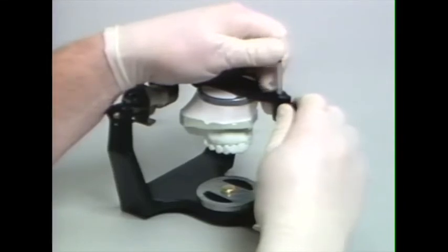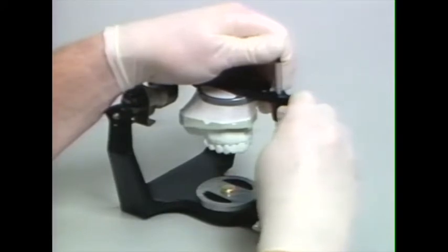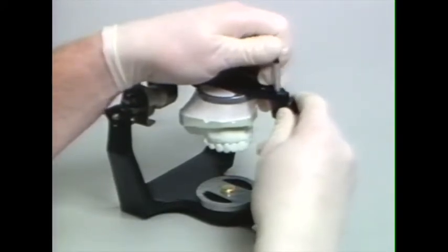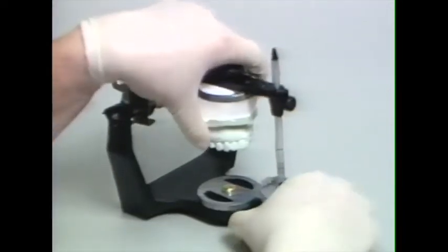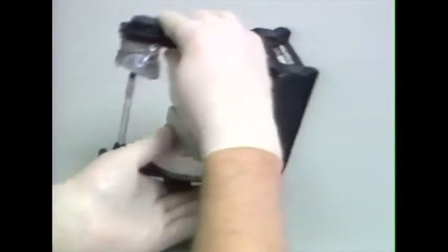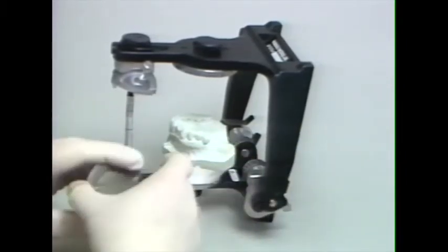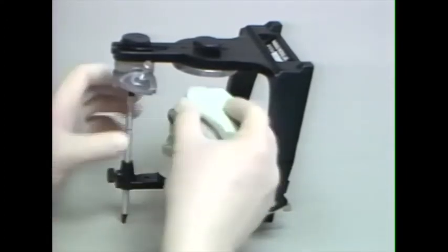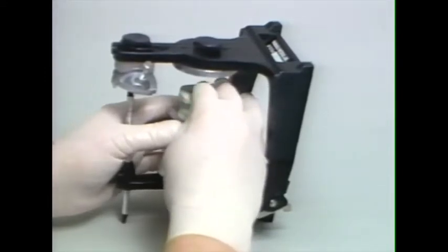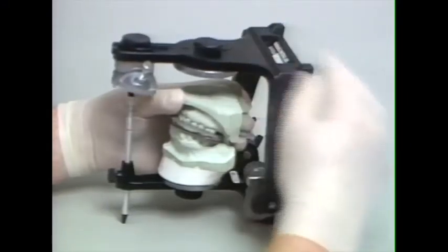In this instance, we are going to mount with an interocclusal record on natural dentition, so we need to drop this incisal guide pin several millimeters. I would estimate that at about 4 millimeters. And we set the incisal guide pin there. Now we invert the articulator, and we can place the centric relation record on the maxillary cast and relate the mandibular cast to that record. Now we are ready to attach the mandibular cast with plaster to the articulator.